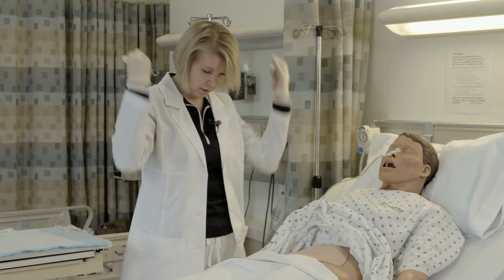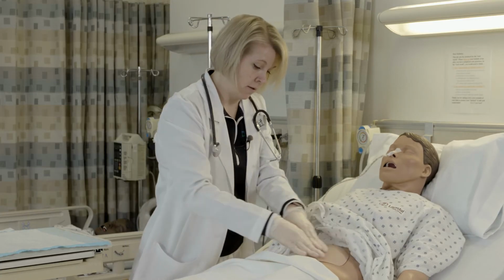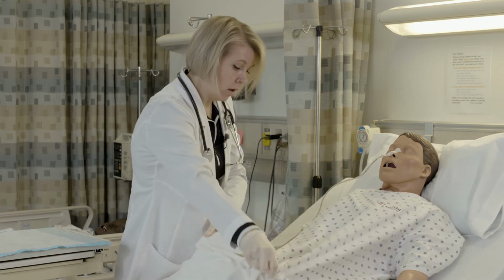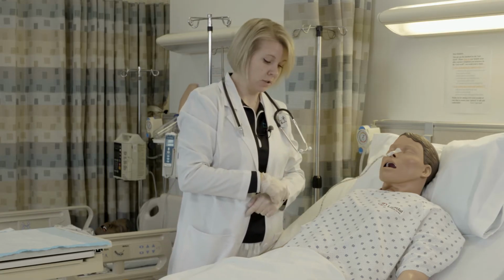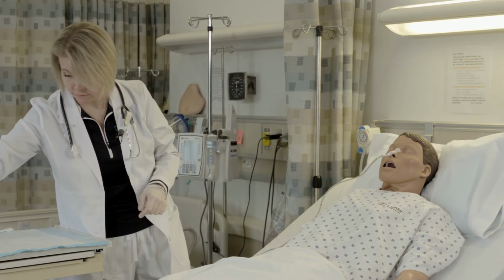And then I will also lightly palpate, checking for pain or rigidity. And the patient's not feeling any pain. I also want to check to make sure that the NG tube is still at the same spot with the indelible ink that it was when it was inserted. And then last but not least, I'm going to check for gastric residual volume.